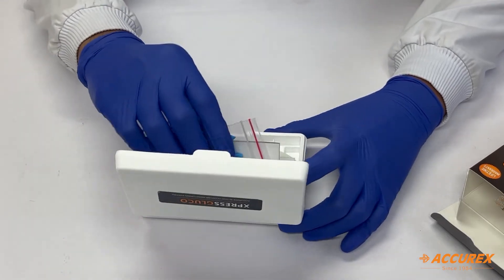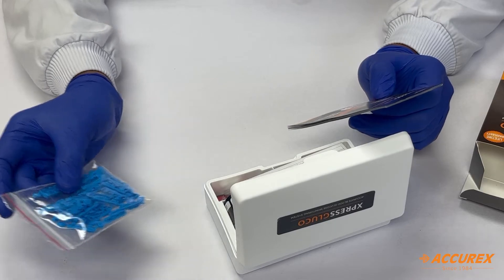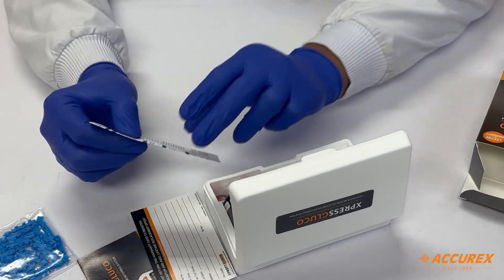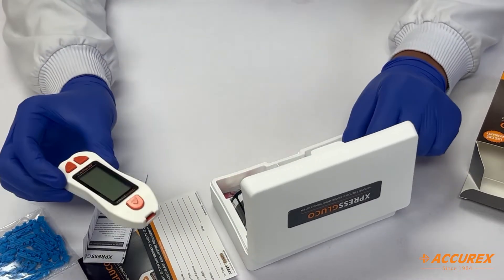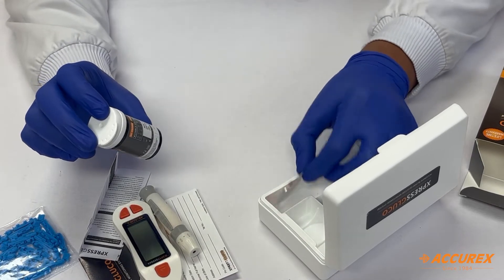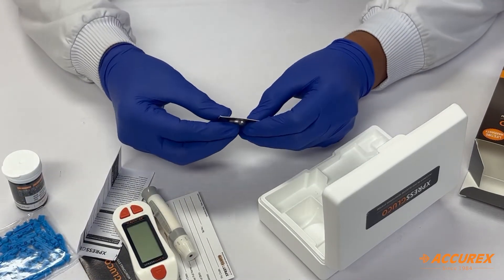This kit contains 10 lancets, along with a user manual, a warranty card, and a strip insert to know the usage of the strips. We also have a monitoring system, a lancing device, and a strip bottle with 10 strips, along with a battery.